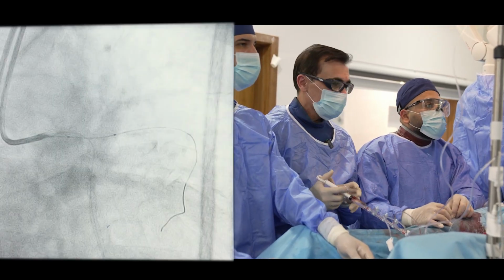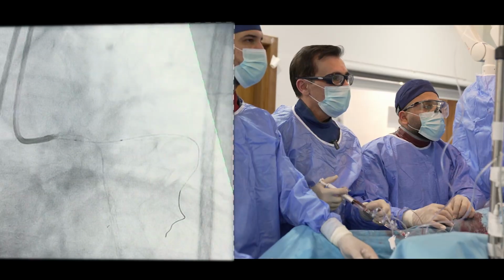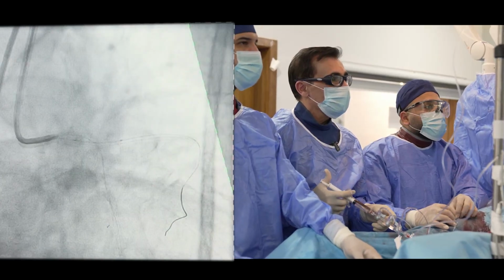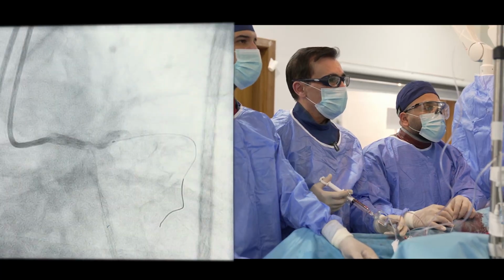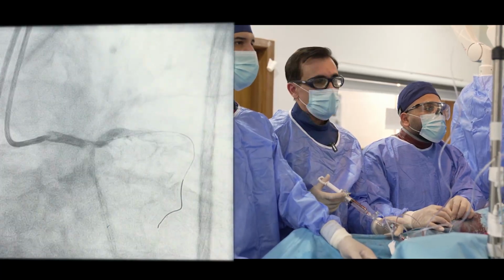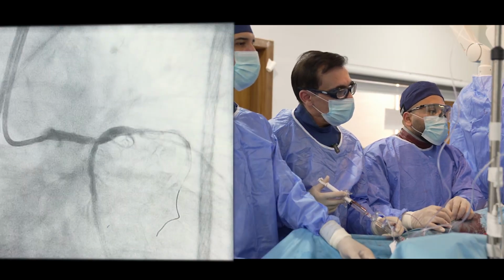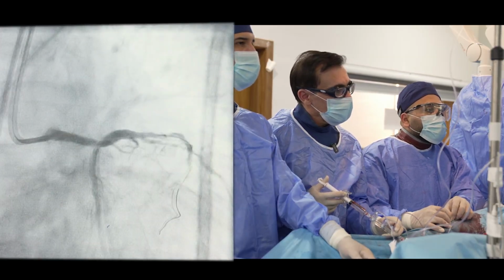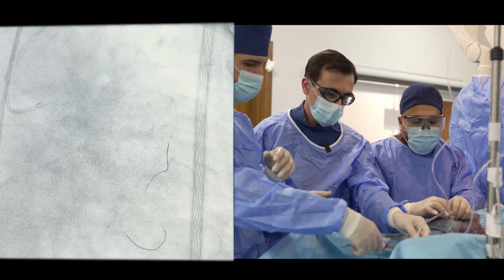Angio. 24 would be good, but we have 22 and 26, right? 26 now. Yeah. I think I'm going to take 26. Okay, 26.